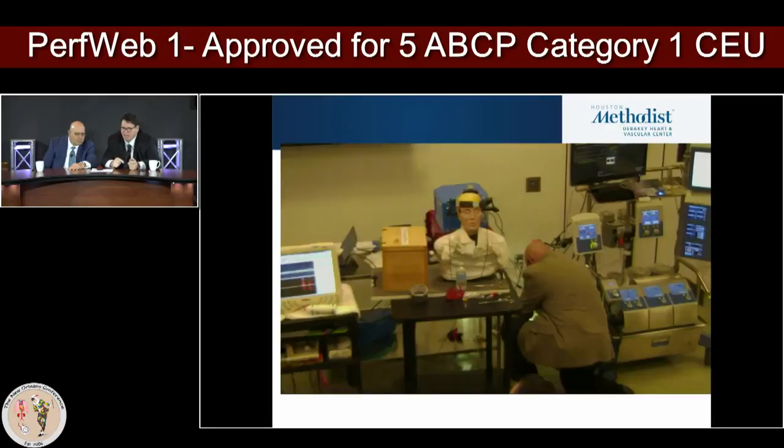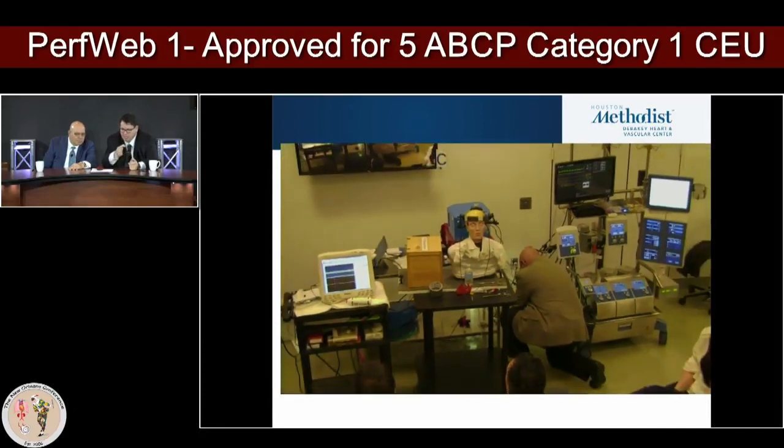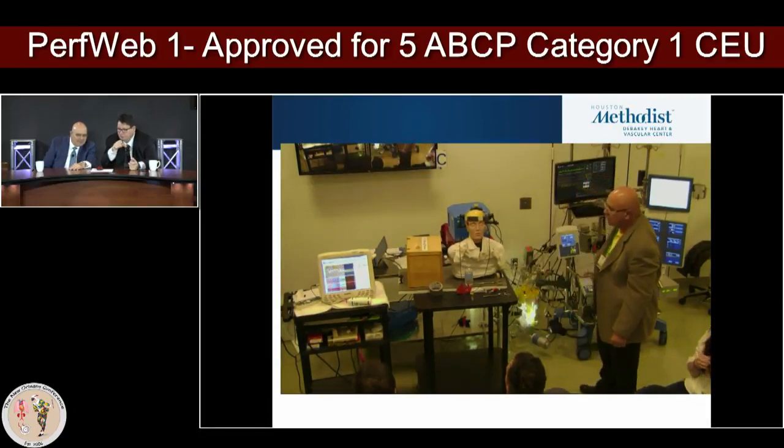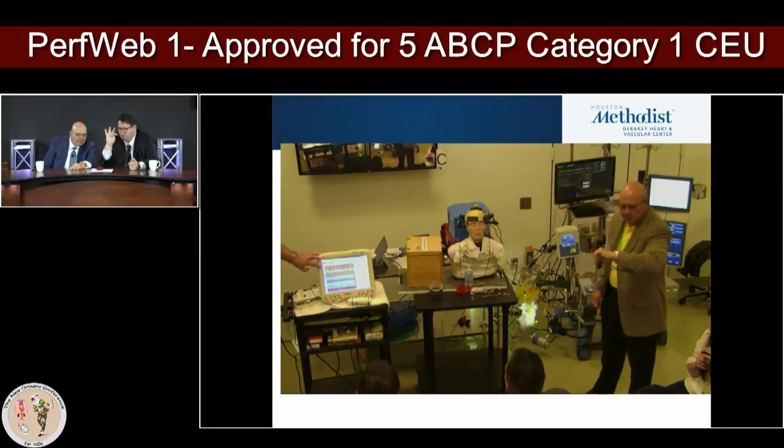And I think we really kept your guys happy. But I just really want to show you this, because I got you on your knees one time, at least. Ready? Go. So you were injecting, and look at all there. So this was a 3 cc air injection, and how we were able to detect the flow in. So you are showing.